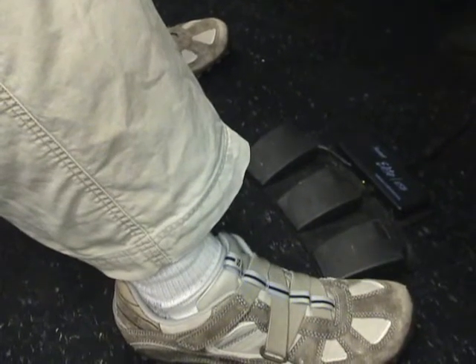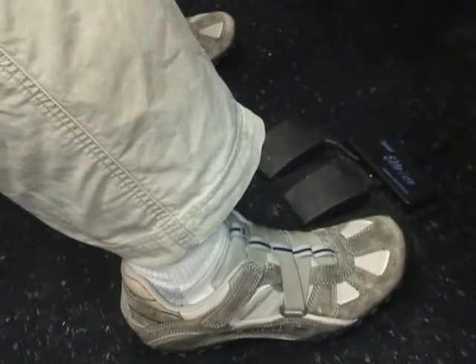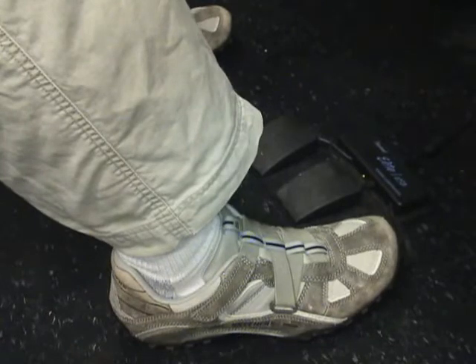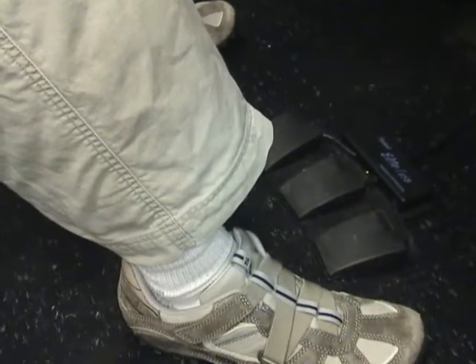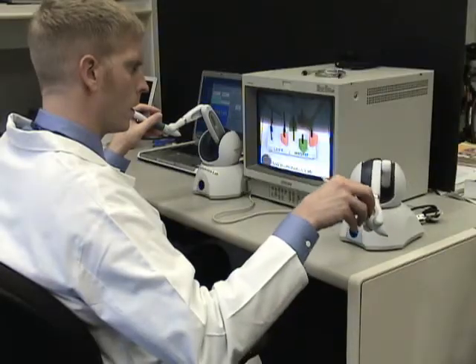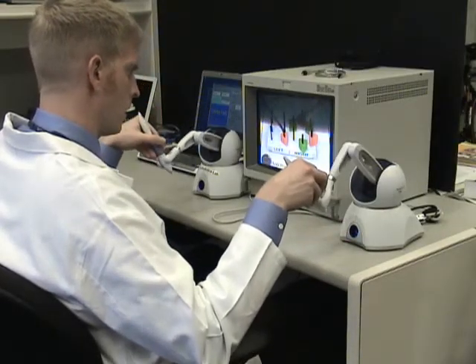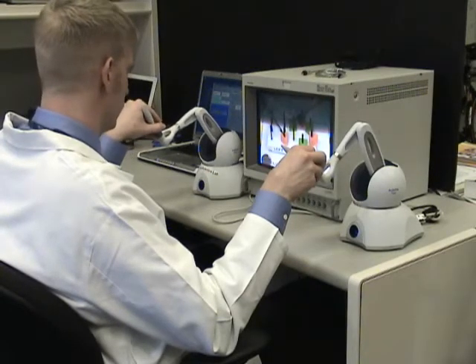Motion increments are only sent from the surgeon site to the patient site when the rightmost pedal is depressed — we refer to this as pedal down. When the pedal is not depressed, referred to as pedal up, motion increments are not sent to the patient site. This allows the surgeon to reposition his or her hands, referred to as indexing.